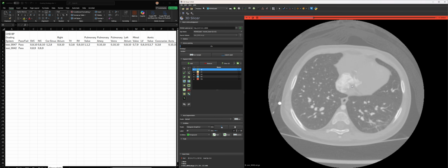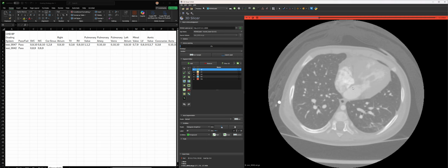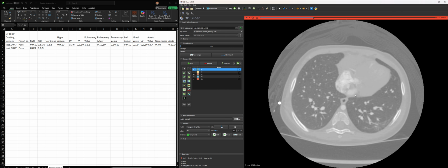Maybe this is the coronary sinus here. Some dark blood returning in. So there's not much there. So that's a -1. It's a 0. I couldn't see anything on the 3D, and I would give it a 0 or 1. I mean, I'm going to give it a 0. There's just nothing there. Nothing to visualize. All right.